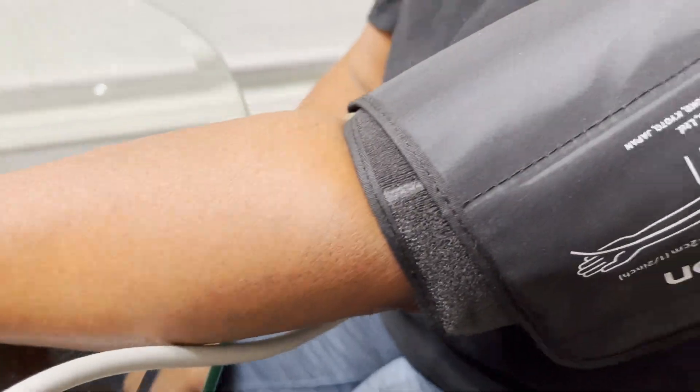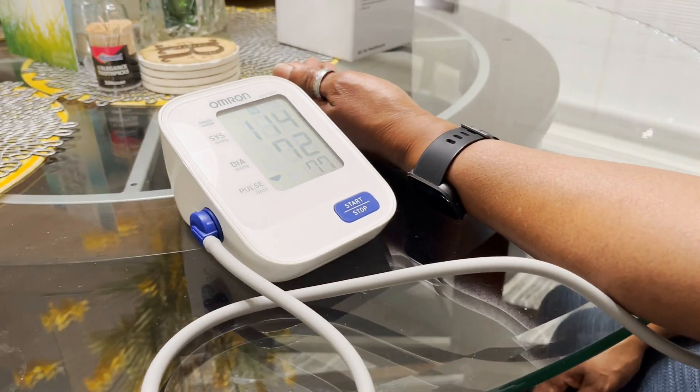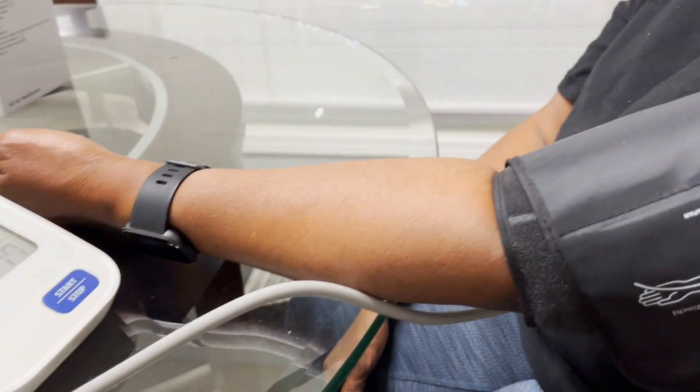So it's good to go, and I definitely recommend you keep one of these inside your home to monitor your situation.